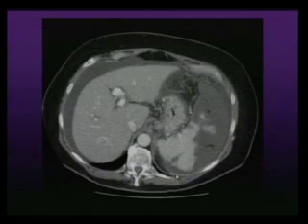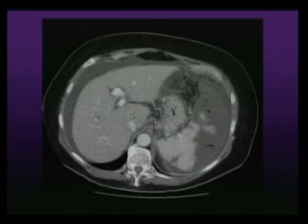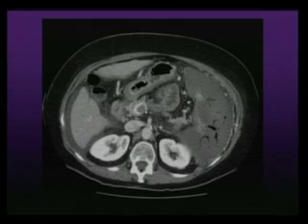So this patient developed ascites. This is the splenic embo, which is normal. But what was worrisome was this. And this patient was supposed to be evaluated for transplant. So when I saw thrombus in the portal vein, not in the intrahepatic portal vein, and I saw this, what they did was they embolized more than 70% volume. See, they embolized a lot of volume here. So it's probably more than 70%. That is why she developed ascites and she developed thrombus of the portal vein.